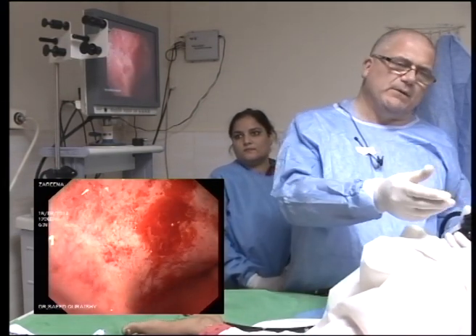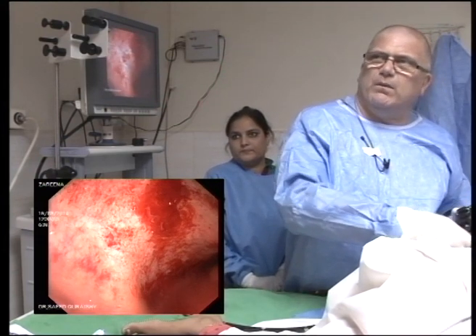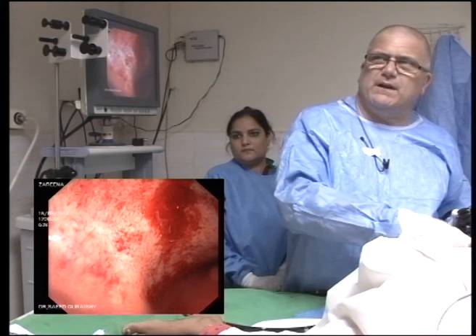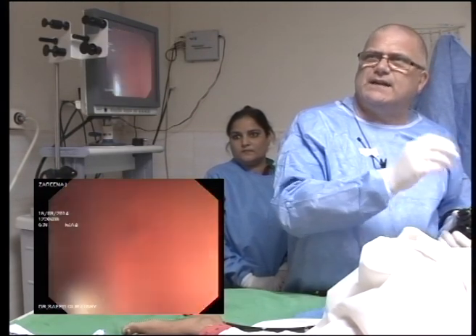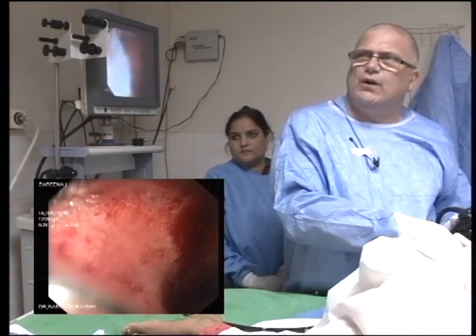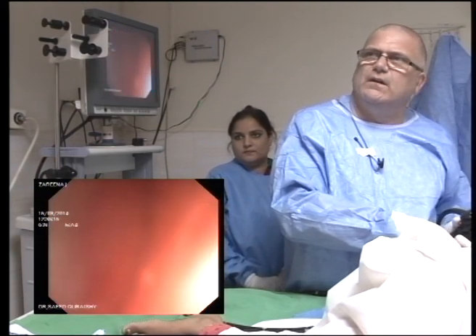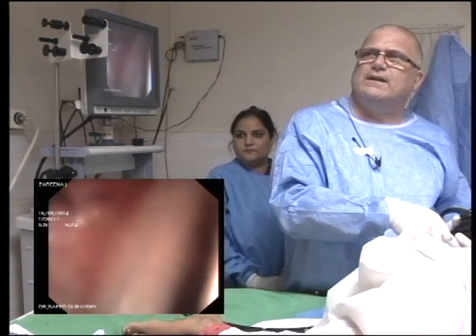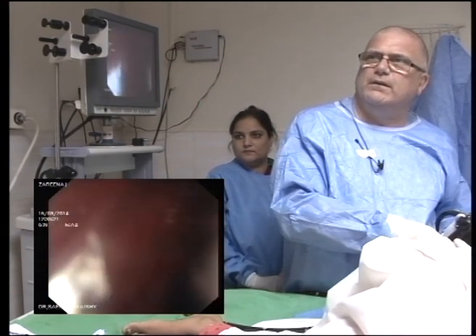Now, because we're in the rectum, I'll do another one of those biopsies just to demonstrate. So that's what I've just done to the left. It's quite a deep biopsy. It's standard when you come against a GIST or anything similar to that. Hirschsprung's as well. It's a standard way of testing for Hirschsprung's. So I'm just trying to clean the lens. For some reason, getting a lot of poo all over.